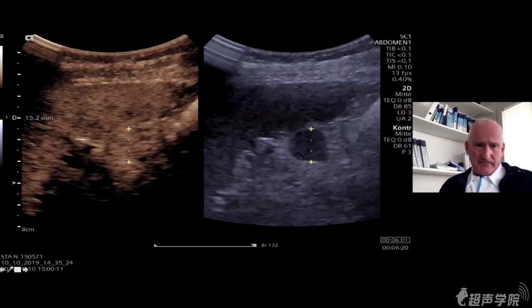Also, after, let's say, 6 minutes, here in the pancreatic tail, we can see sustained enhancement, still a dosage of 0.6 ml in that respective patient. It's a typical accessory spleen. Sustained enhancement, stability is nicely displayed.